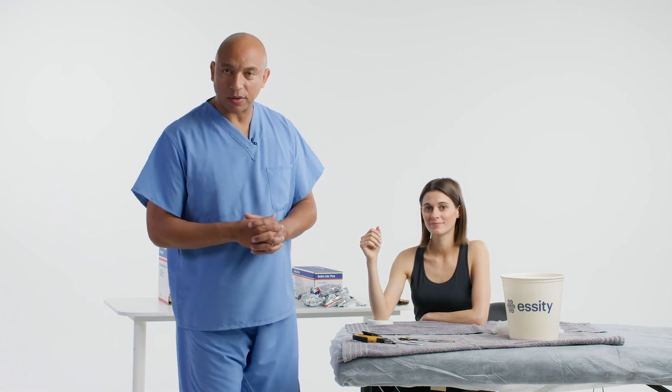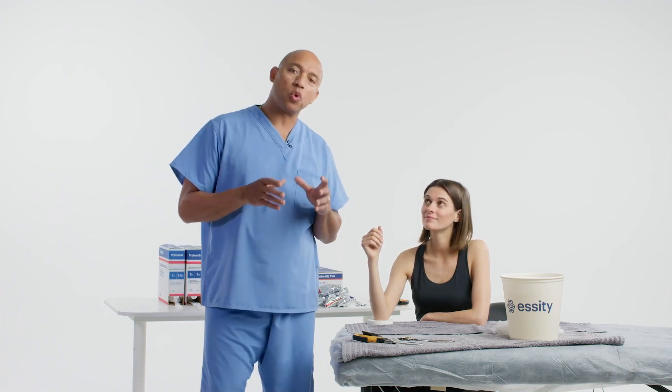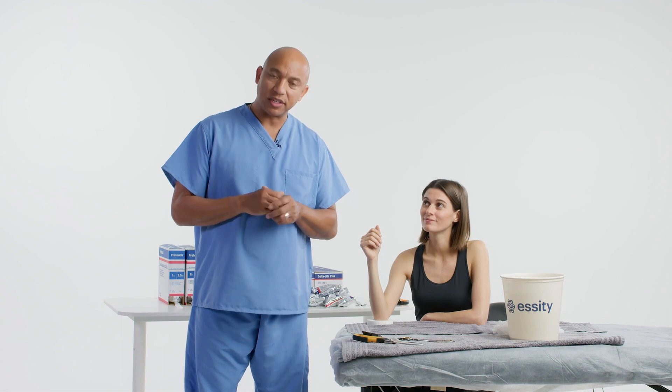Welcome to DeltaCast Tutorials. Today, I'll be applying a short arm cast using DeltaLite Plus.